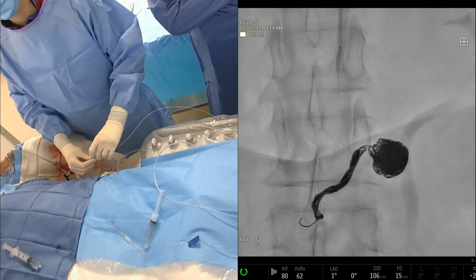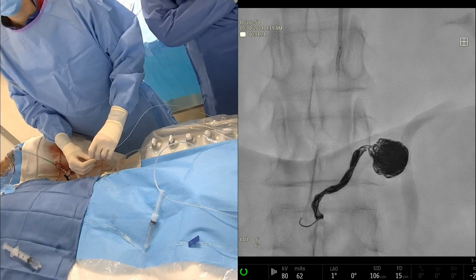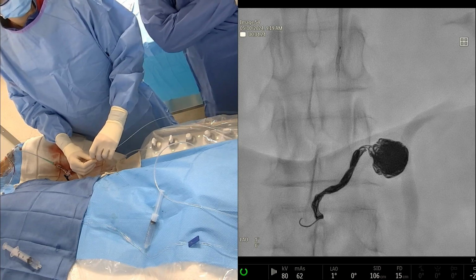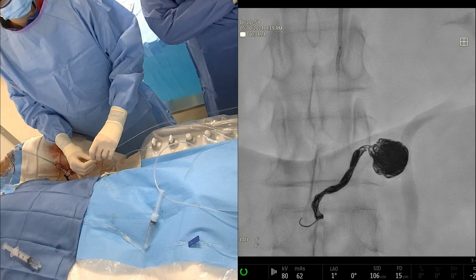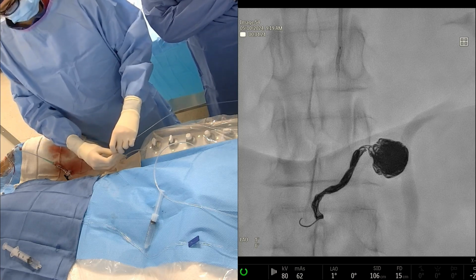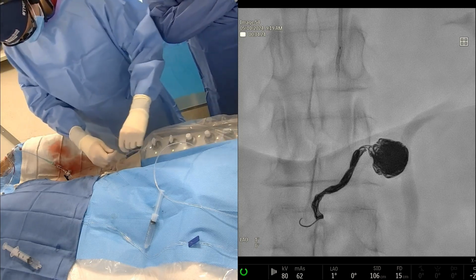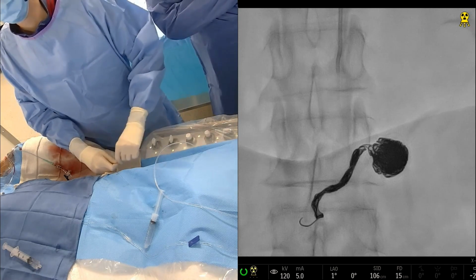I think the older Interlocks, you can use them. We've all had issues with the hooks and stuff. For bigger aneurysms, it's kind of annoying. They're a bit stiffer. The Medtronic coils would also work, but again, they're a little bit on the smaller side, and their size matrix isn't as great. And same with Terumo, I think I have the same problem.